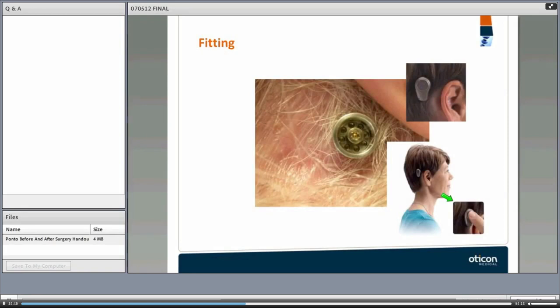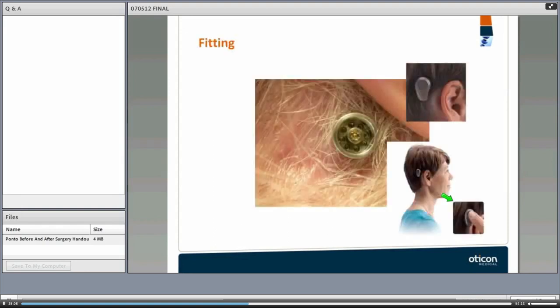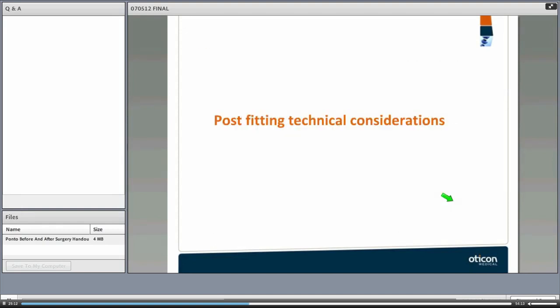Going through the post-operative evaluation and fitting process: this is how the abutment looks when it sits nicely on the skull, and this is how the processor looks when attached to the abutment after fitting.